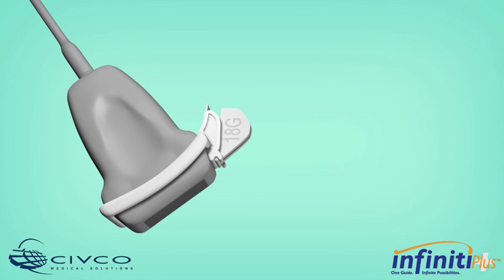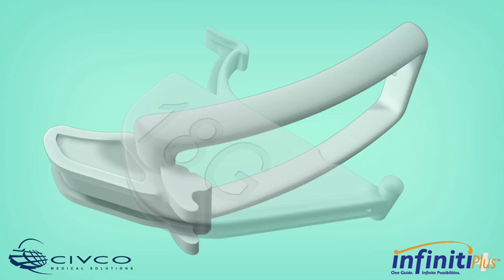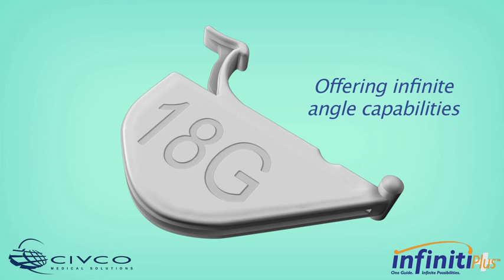CIVCO Needle Guidance Systems utilize a two-part system consisting of a custom reusable bracket and a disposable snap-on needle guide. Infinity Plus offers a unique open channel with infinite angle capabilities.